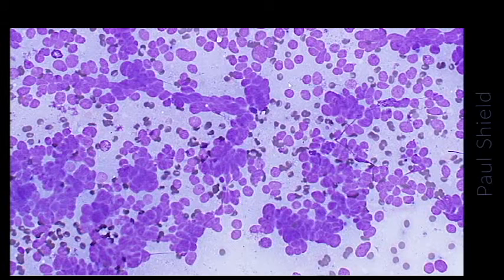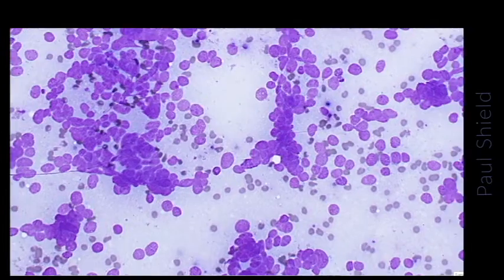So this would be almost what we would call a small round blue cell tumour on histology. So it's an undifferentiated looking malignancy, and it seems to be moulding quite a bit.